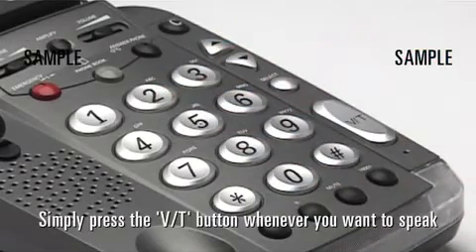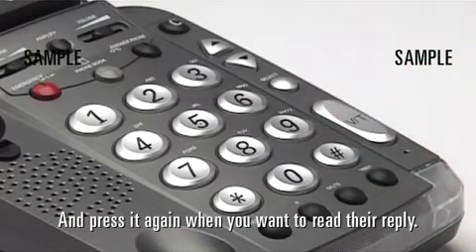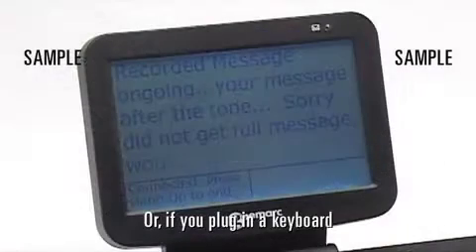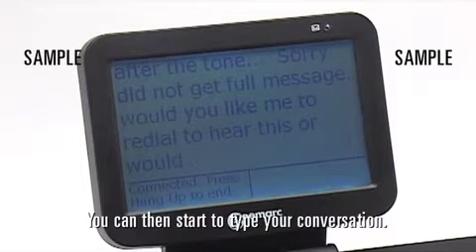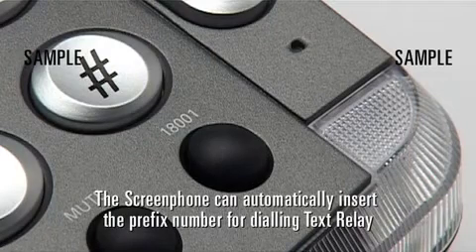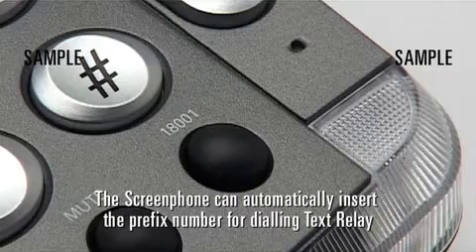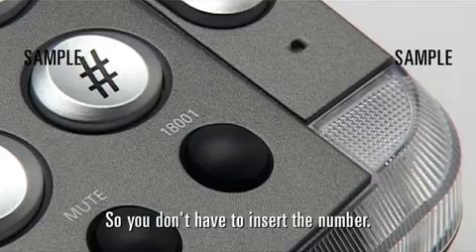Simply press the VT button whenever you want to speak and press it again when you want to read their reply. Or, if you plug in a keyboard, use the ScreenPhone as a text phone and start to type your conversation. The ScreenPhone can automatically insert the prefix number for dialling text relay — the text phone relay service — so you don't have to insert the number.